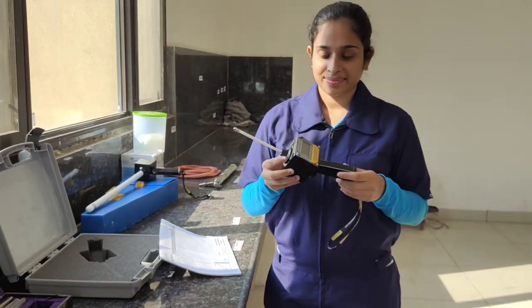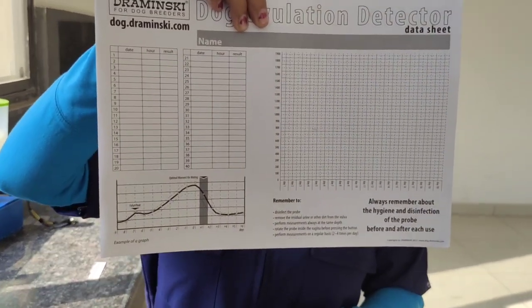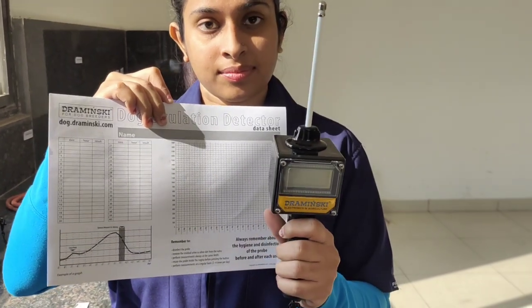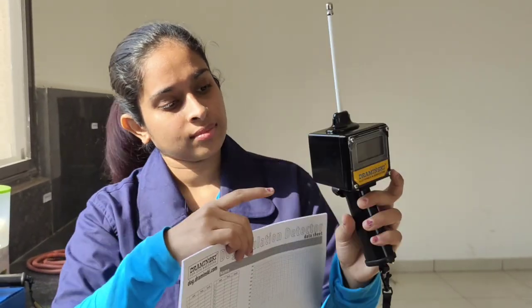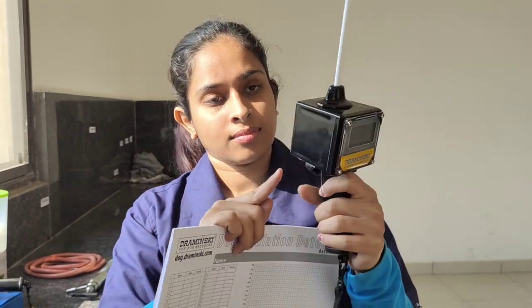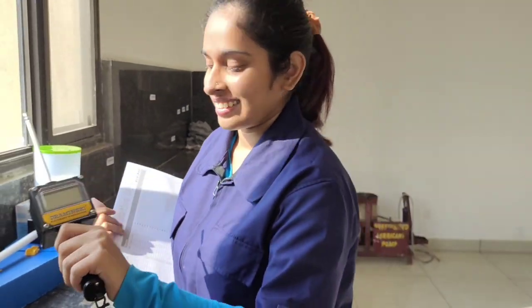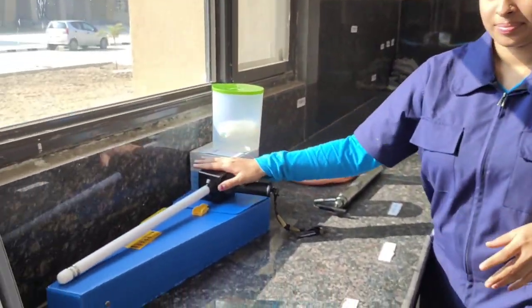The next instrument is called the dog ovulation detector. Various charts are provided with this instrument which we can use to graph the estrus cycle of our dog. This instrument is based on the principle that the value of electrical resistance determines the optimum mating period in a dog. We insert the tip into the vagina of the female dog, push the button at the back once to start it, then push it three more times at roughly one second intervals. On the final press, we can see the recorded electrical resistance reading of the cervical mucus on the screen. This is an easy and cost-effective way to determine the optimum mating time and has been used by breeders all over the world.